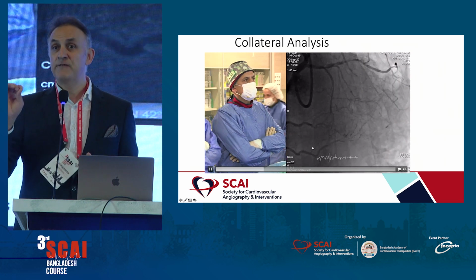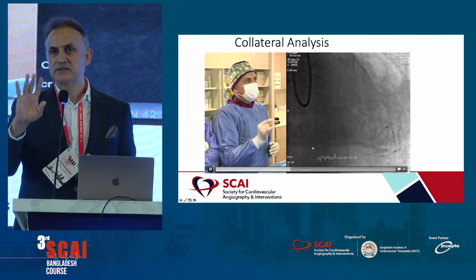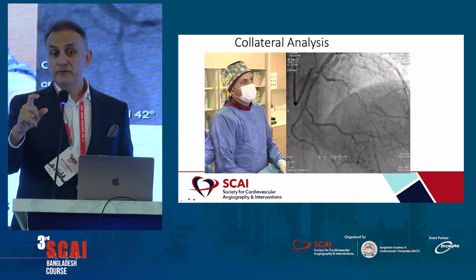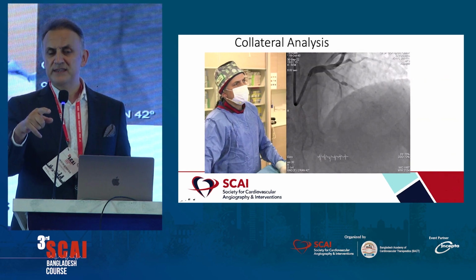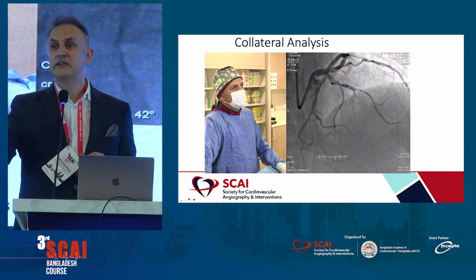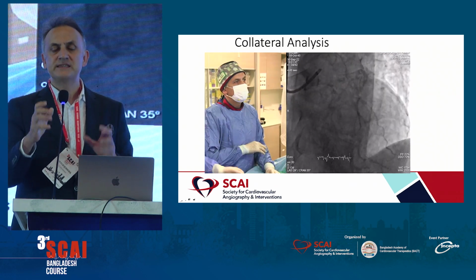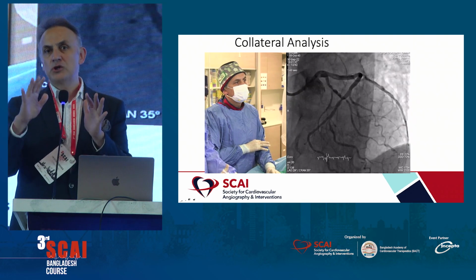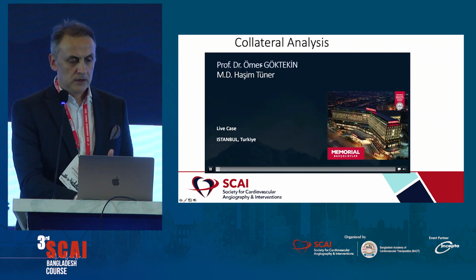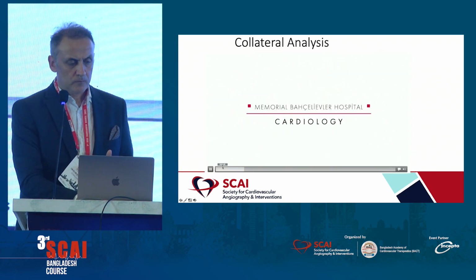So we can do this case definitely with the help of IVUS. IVUS can show us where the proximal cap is. That's for sure. But also we have a very nice collateral. I'll show you that. This is a live case, and you know time is important. I started directly with a retrograde approach, and I believe that if I do retrograde, I can open this case in a shorter time than if I try antegrade first with IVUS guidance. Let's see how we approach this case.